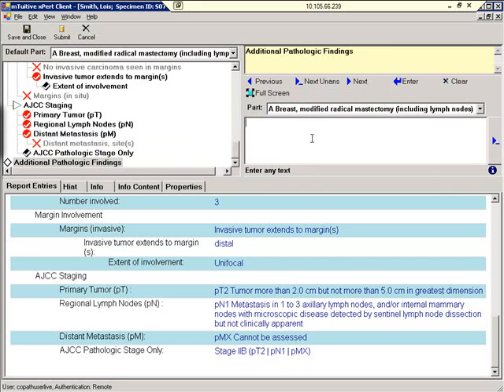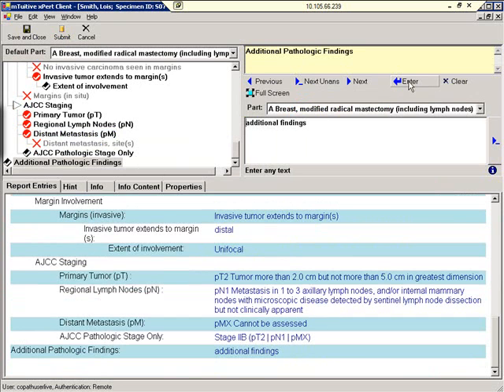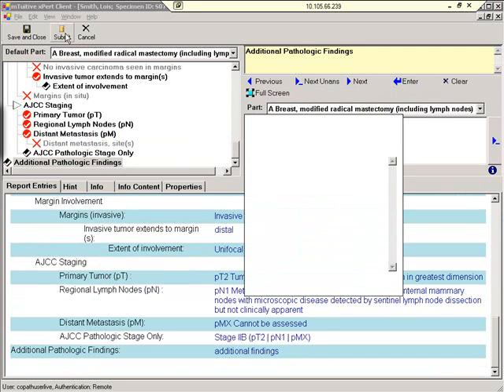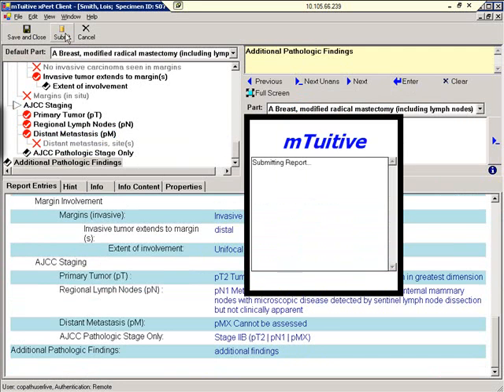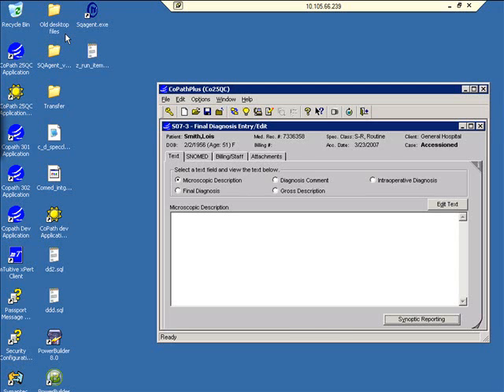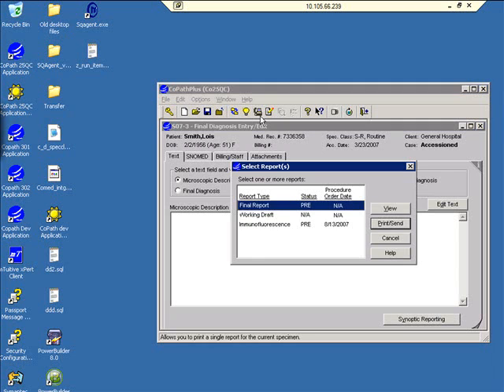The pathologist can enter additional findings and comments. When you're done and ready to submit your report to CoPath, simply hit the Submit button. To view your report in paper form, simply click on this button. This will launch Microsoft Word, and you can show the Synoptic report in the final report.